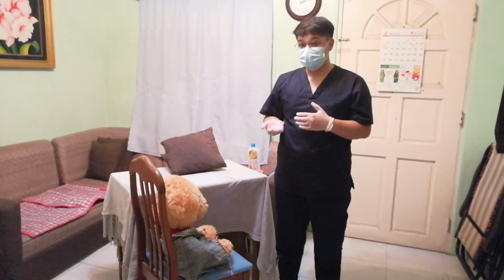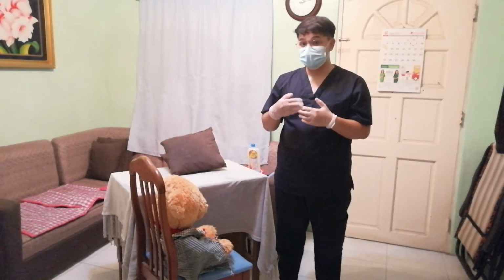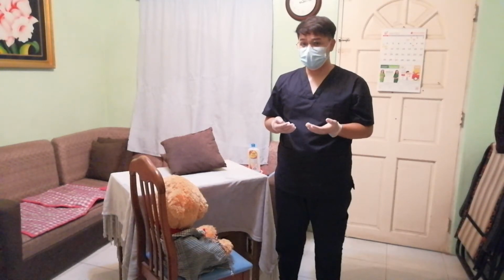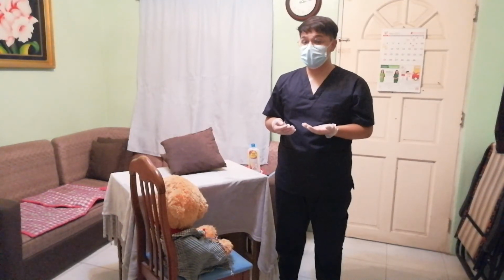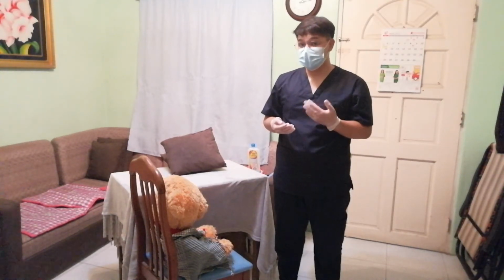Depending on the patient's comfort, it could be left in place for use when returning the patient to the bed. And after that, we will need to cover the patient with the blanket. And after that, we need to make sure that the call bell or other necessary items are within easy reach.